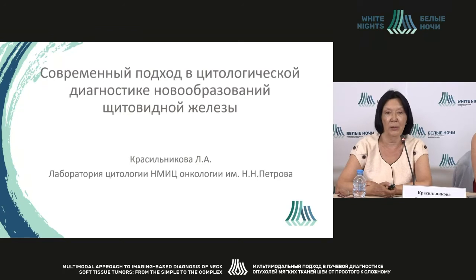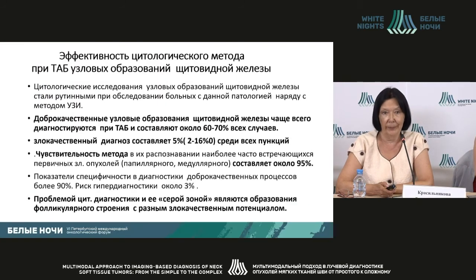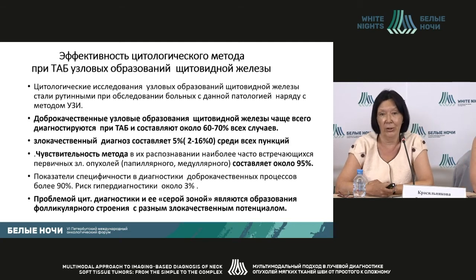My greetings to you. Let me introduce my presentation dedicated to the cytology diagnosis of thyroid neoplasms. First of all, let me tell you about the method efficacy, and I will mention some figures that are of interest and describe the opportunities and problems of the cytology method.